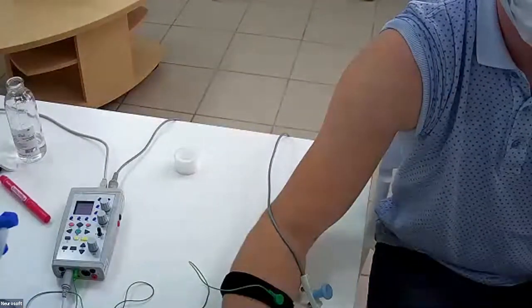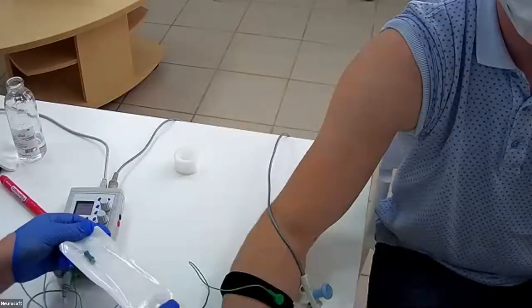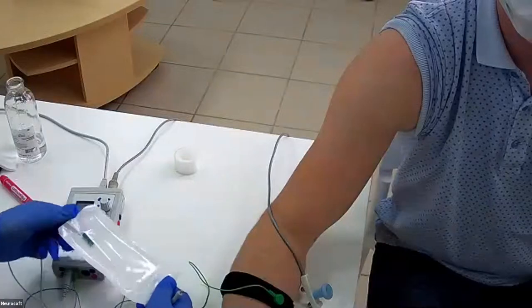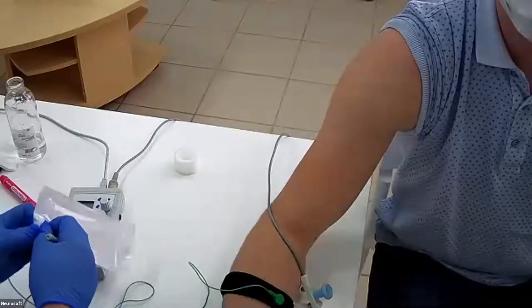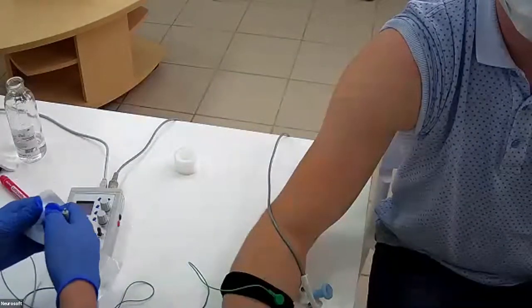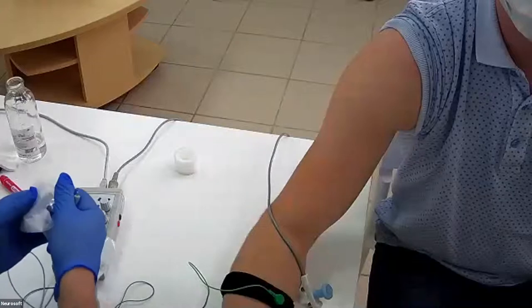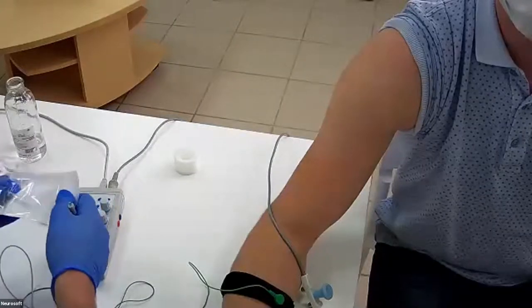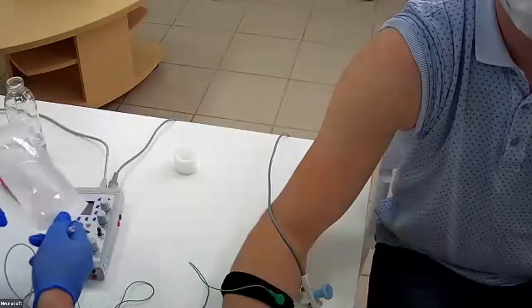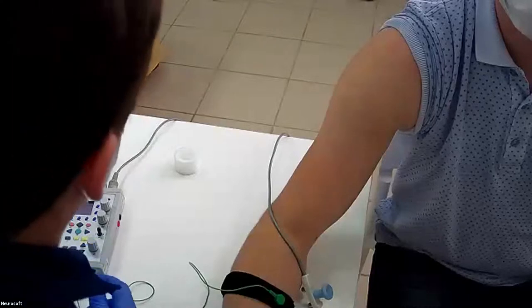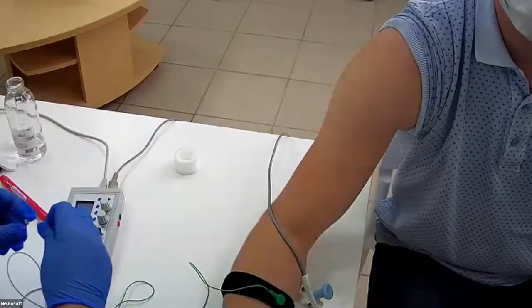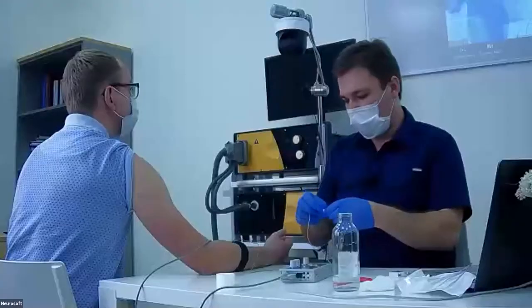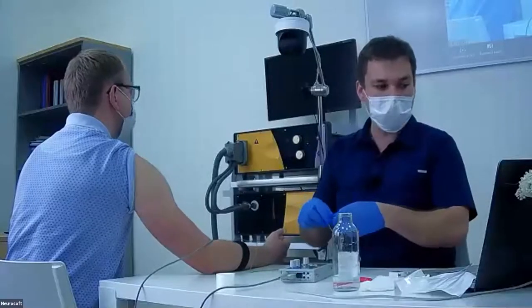We take the needle, for example this. We will use a concentric needle, but some medical societies prefer monopolar needle. It's possible to develop the examination with both of them.